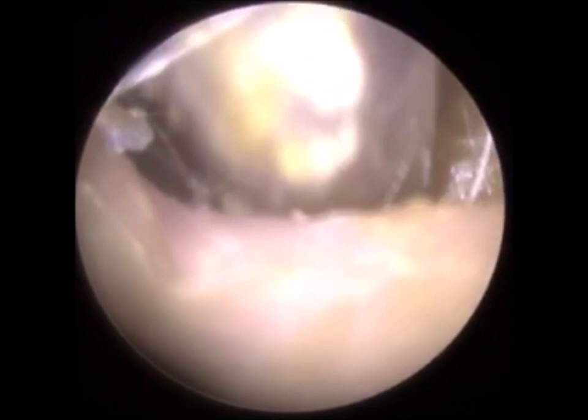We're nearing the end of the video, and you'll see at the end of the video I had to stop. It's just because the patient was getting a bit dizzy, he was experiencing the caloric effect. So when we vacuum the ear, people can often experience a bit of vertigo, and that's because of the vestibular system, the balance organs located in the inner ear, and cool air, which is what the suction probe introduces into the ear, can inhibit the balance organ. And remember, we've got two balance organs. So the balance organ in this particular ear is being inhibited.